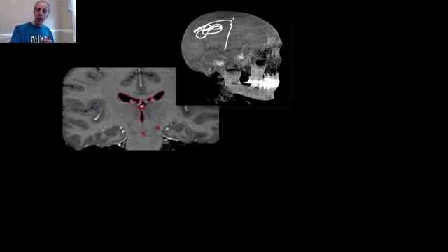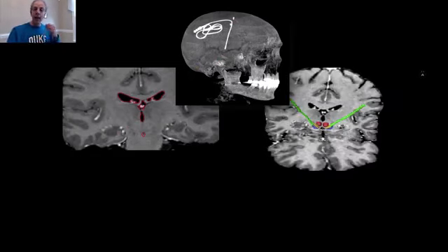We have segmentations of the regions, and then the neurosurgeon can see after surgery, was I in the right place? As I say, the subject is awake and giving feedback to the neurosurgeon. For example, if it's a surgery for Parkinson's, you can experiment with different behaviors to see if they improve with the position of the electrode.